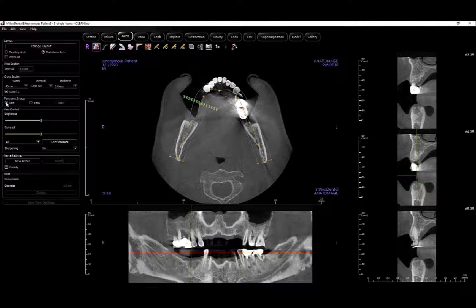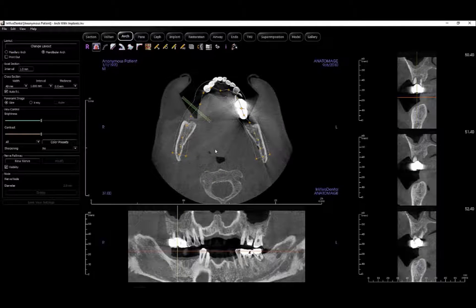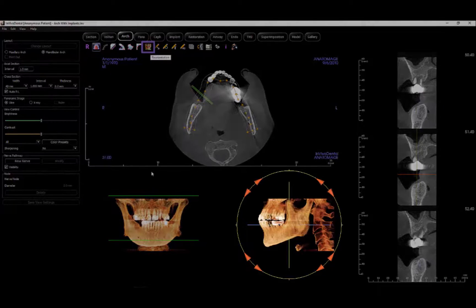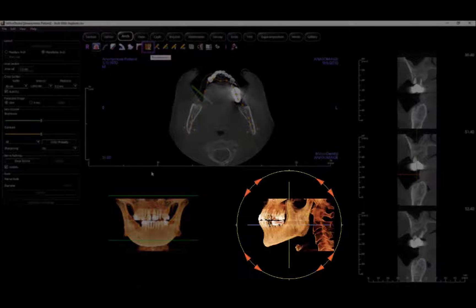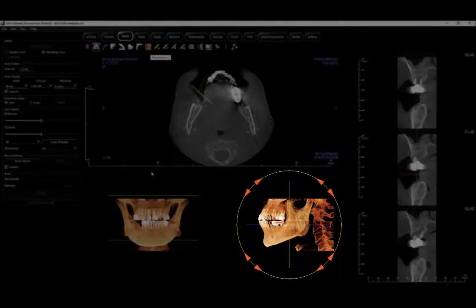Now we will go through the typical workflow for creating an arch spline and tracing the nerve. First, adjust the range and orientation of the scan using the reorientation tool. You can rotate the scan to ensure that the occlusal plane is leveled horizontally if necessary.